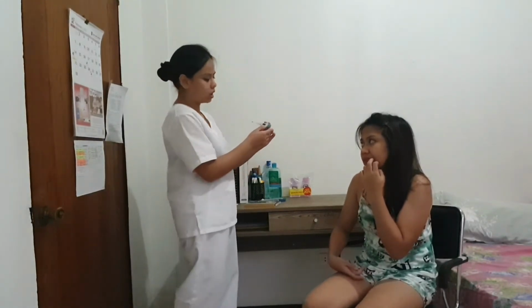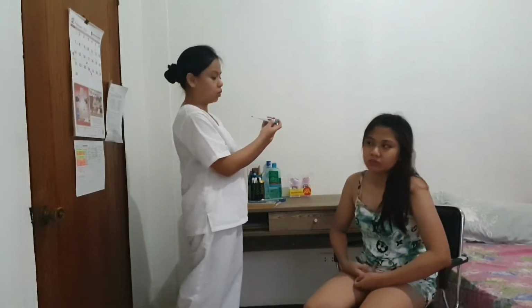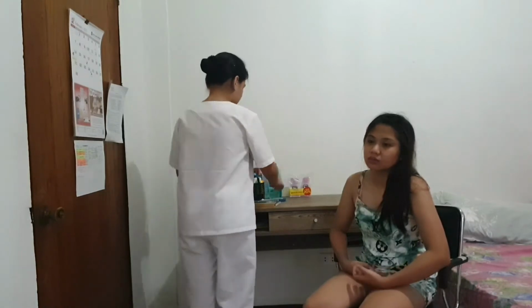So the temperature has finally beeped, and the temperature of my patient is 35.5 degrees Celsius from her underarm. Okay, so I am going to record this on my worksheet, but before anything else, I'm going to wipe my thermometer with alcohol swab first.